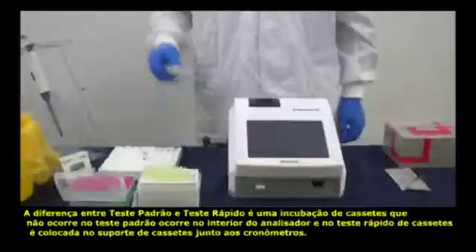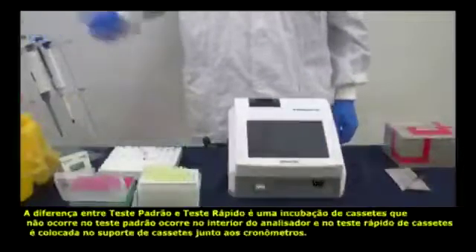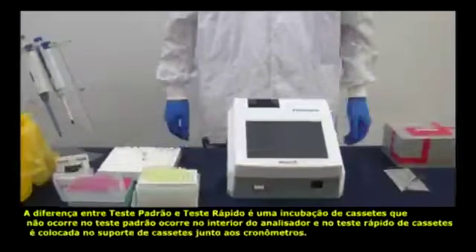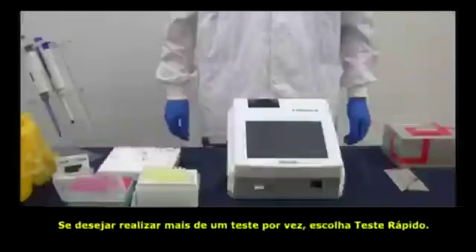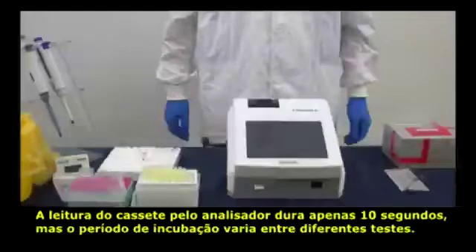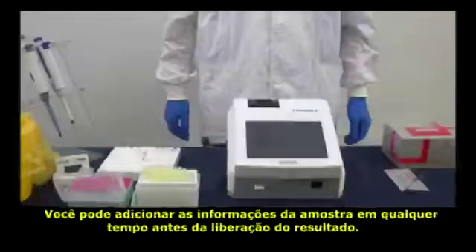Notice: first, the difference between standard test and quick test is whether incubation occurs inside or outside the device. Choose quick test if you have numerous samples to test. Second, the reading time only takes 10 seconds for all tests, but incubation time for each test differs. Third, you can enter the patient's information at any time before the result is released.